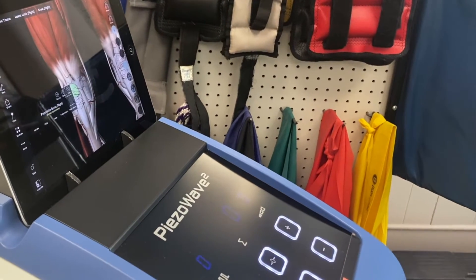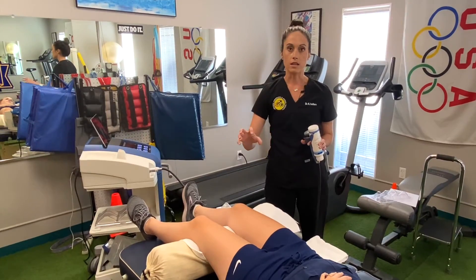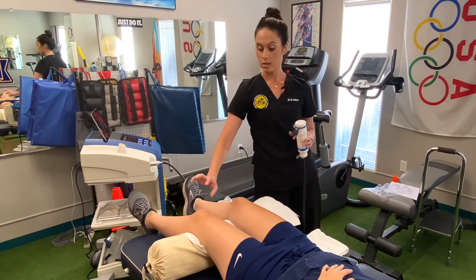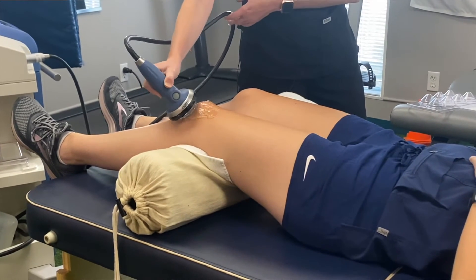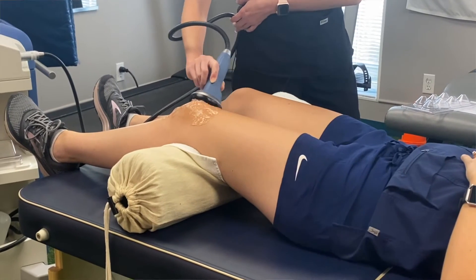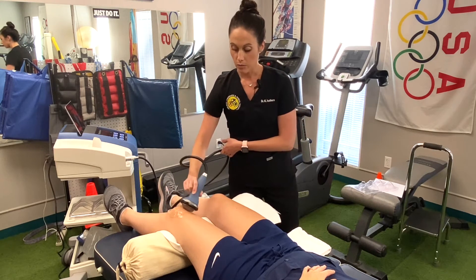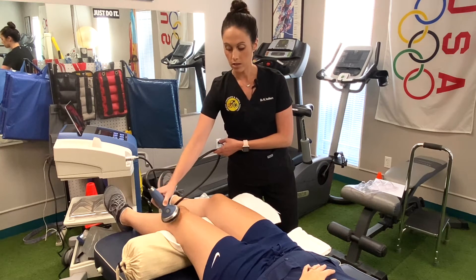One thing that's great about the machine is it really helps us pinpoint the pain rather than treating areas of referred pain. A lot of times patients come in experiencing pain on the inside of their knee when the actual source is somewhere else in the knee. What the patient will feel is basically a dull ache, and they may feel some shock-like sensations. We do want a little bit of discomfort — when we find an area of discomfort, we treat that area and hold the source there until the pain starts to subside a little bit.